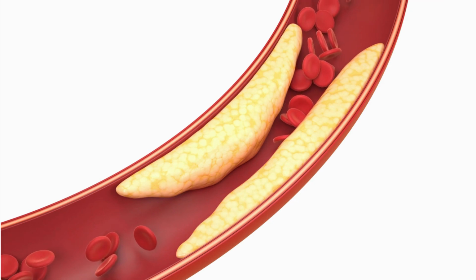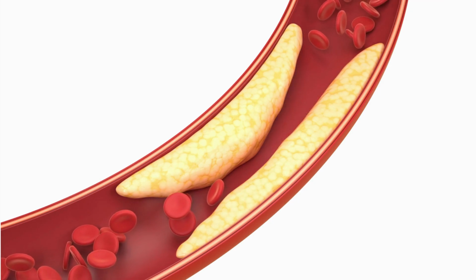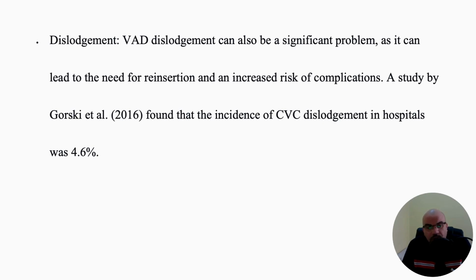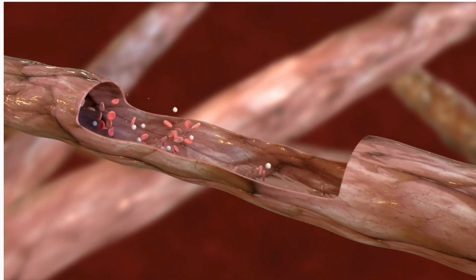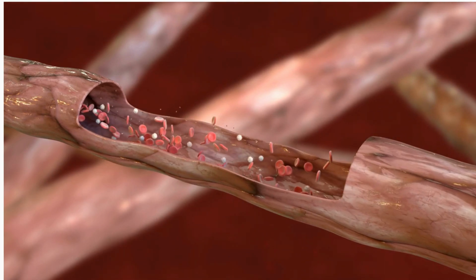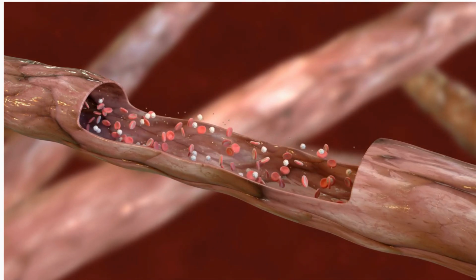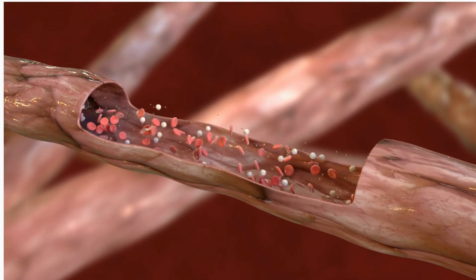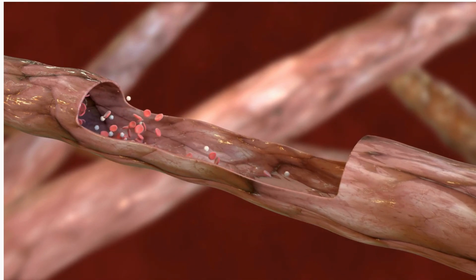One of the most famous problems is dislodgement, which happens from dislocation or removal, and leads to what we call infiltration, when the IV line starts to deliver the solution or substance outside the vein, or the vein wall itself is damaged, so it starts to swell or leak this material. And also, as we know, dislodgement of the IV line can be from accidental removal of the access.